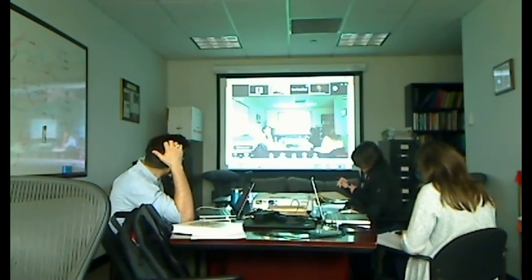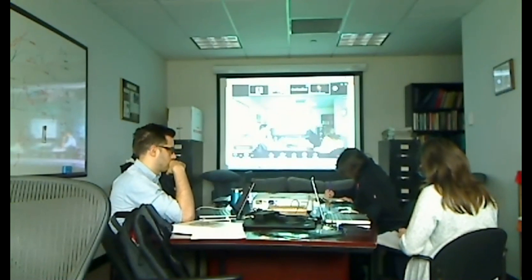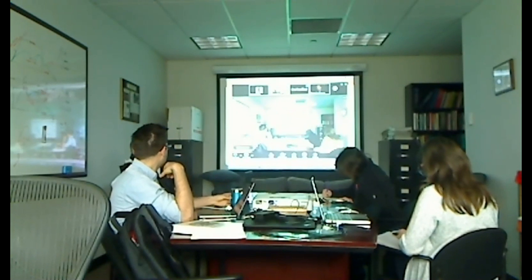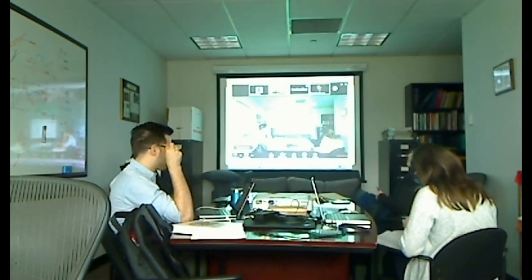I don't know. I guess we need to. It seems like we need to get some more concrete notions of when to smooth or not. I think in the past we wouldn't smooth. We'd extract the data from each individual. We wouldn't smooth, but then we would smooth along the surface. No, actually, I take it back for the ROIs. We probably don't need to smooth. But if we were going to smooth, then what we'd want to do is smooth along the surface, not in the volume. Right.